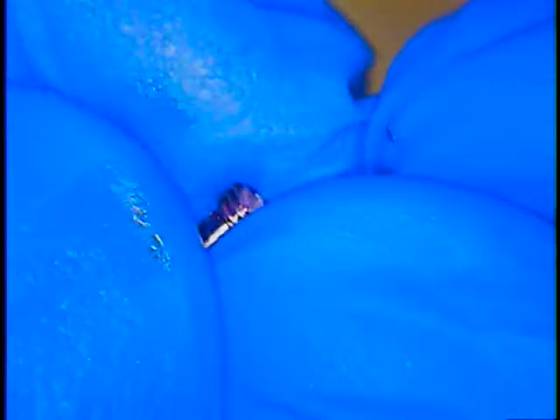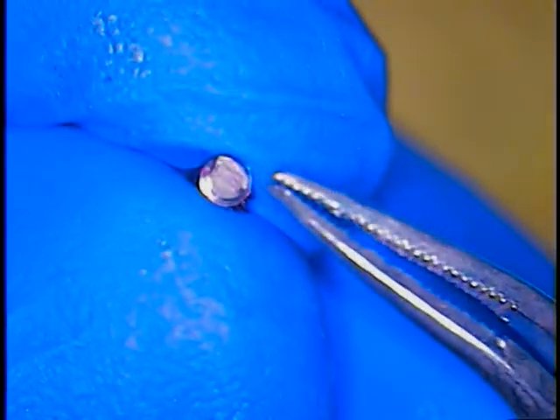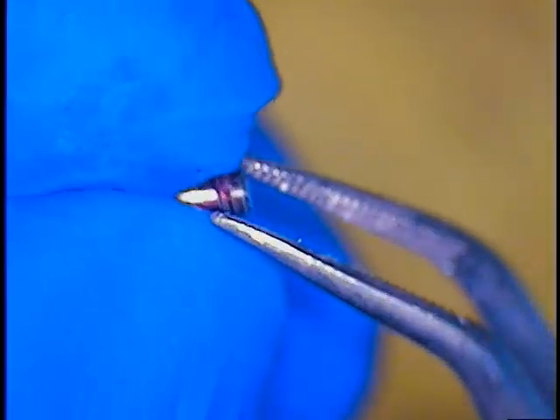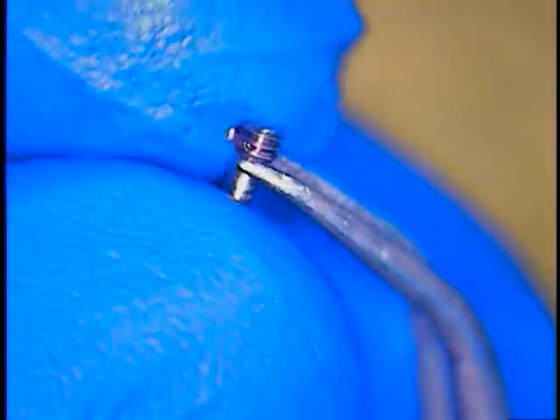Just suction right on top of that — come right on out. I'm going to show you this little screw. Oh boy, we've got another part in there that's threaded — so it's in two parts. This one broke in two spots, so there is another piece of screw down in there. It's a two-part fracture, which is a pretty rare one.